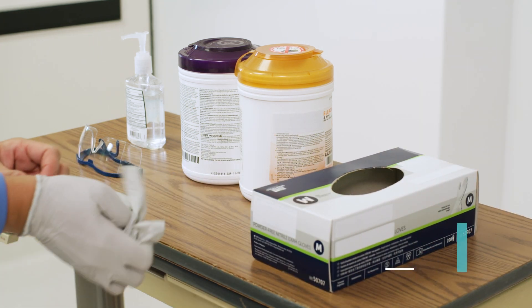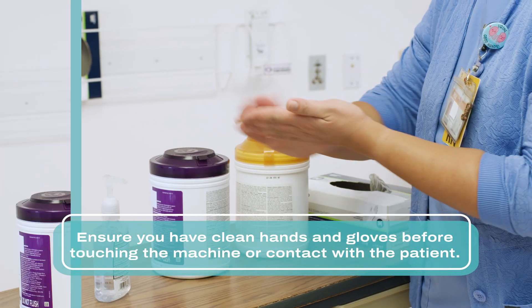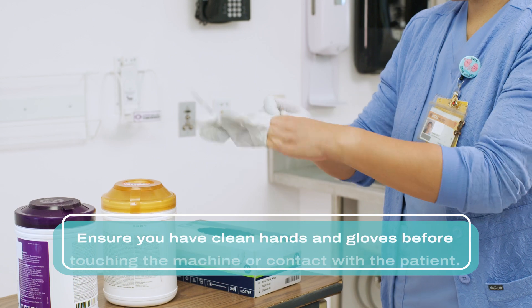Once you've gathered all necessary supplies, doff gloves, perform hand hygiene, don goggles, gloves, and any other required PPE.